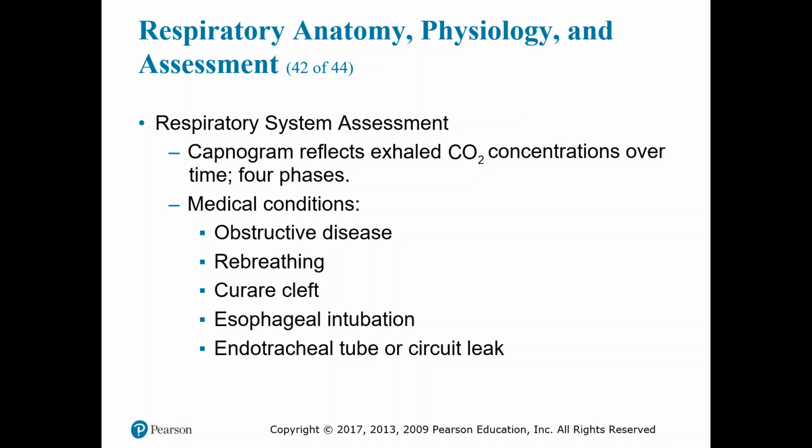Continuous waveform capnography also adds the ability to help troubleshoot hypoxemia and difficult ventilation and assess for bronchospasm, pulmonary embolus, and so on. The continuous waveform capnography also has utility in monitoring non-intubated patients. By following trends in the capnogram, pre-hospital personnel, paramedics, and EMTs can continuously monitor the patient's condition, detect trends, and document the response to medications.